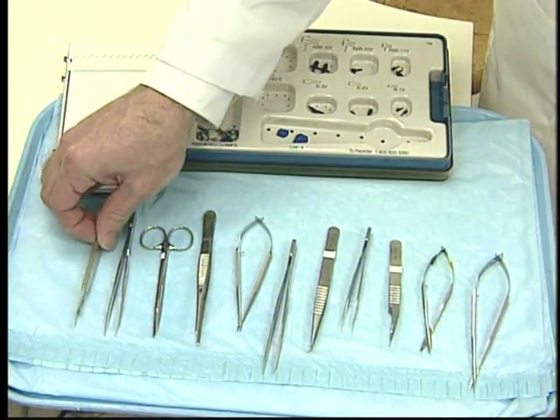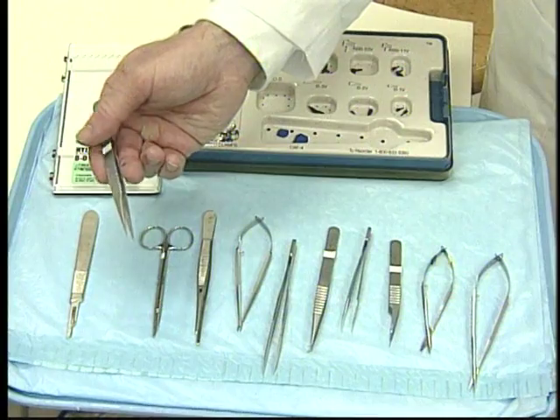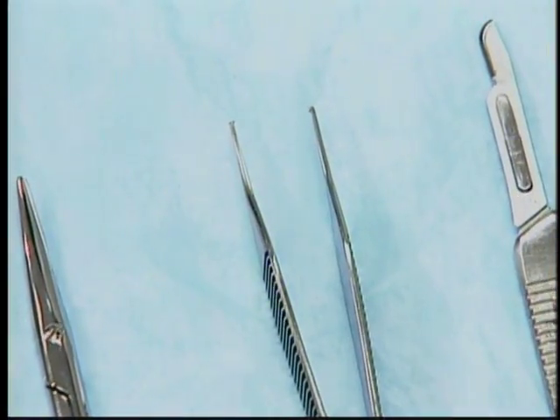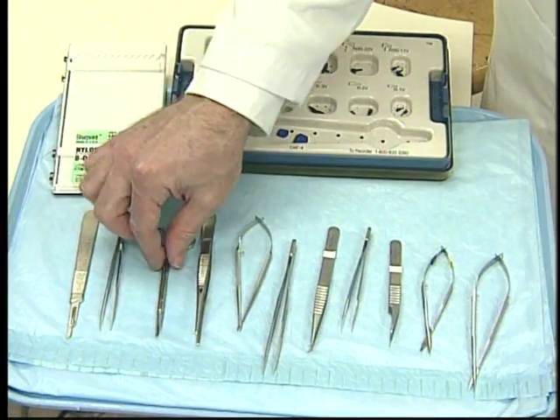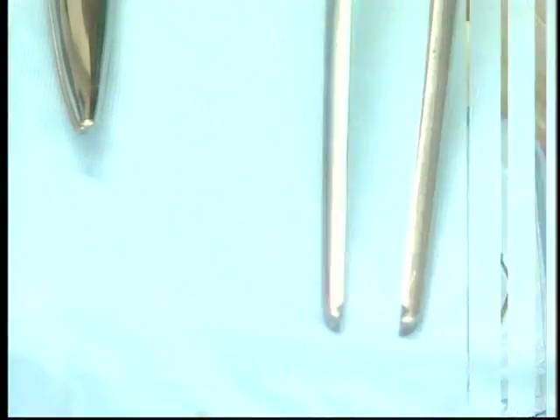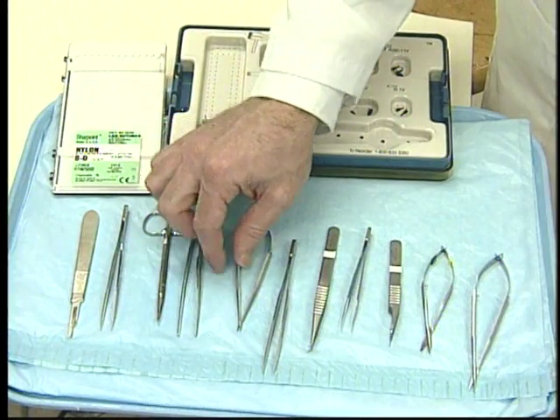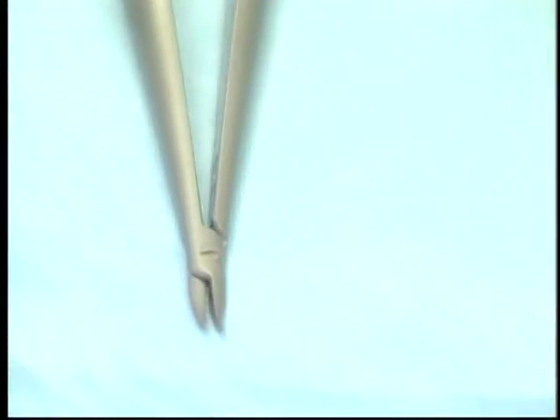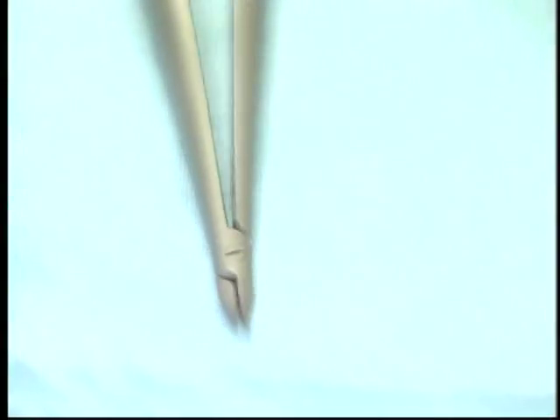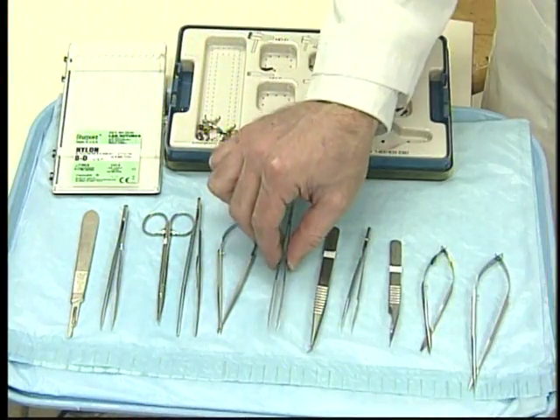First, a standard scalpel blade with number 15 blade, and a tissue forceps for dissecting the superficial layers of the laboratory rat model. Also a scissors for dissecting purposes. Next, a clamp applicator for applying the fine vessel micro clamps. Next, a curved needle holder that is used for grasping the needle for suturing purposes. Next to that, we have a sturdy jeweler's forceps, and these are all microsurgery instruments used for dissecting the vessels.